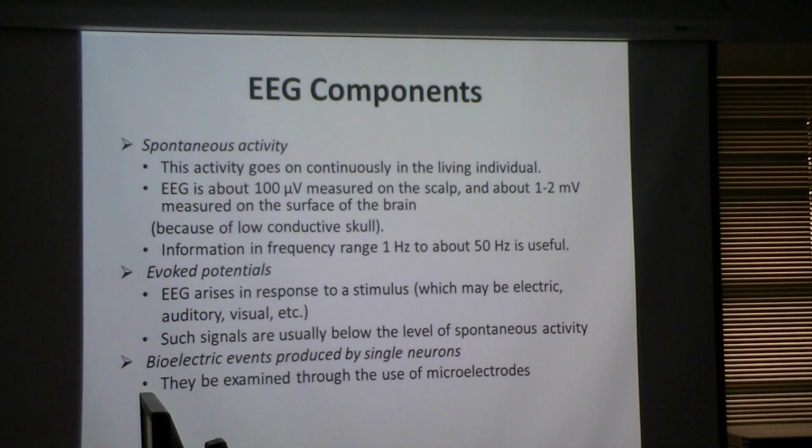The last thing is bioelectric events produced by single neurons. If you have to take the output from a single neuron, you have to use a microelectrode, which pinpointedly tries to contact a single neuron or some tens of neurons, because neurons are very, very small, so they can be examined using microelectrodes.